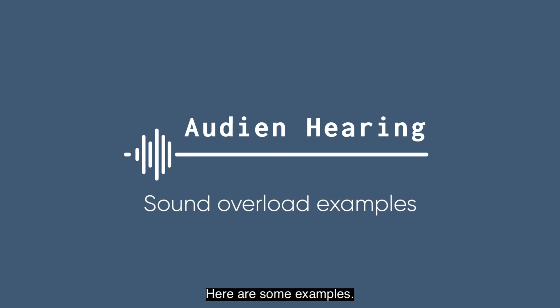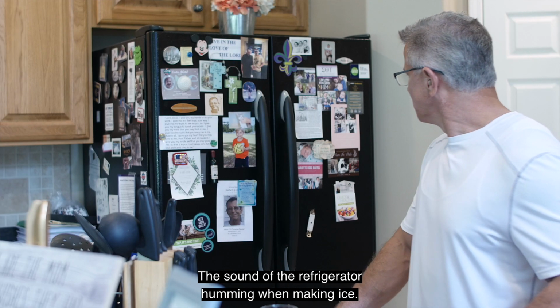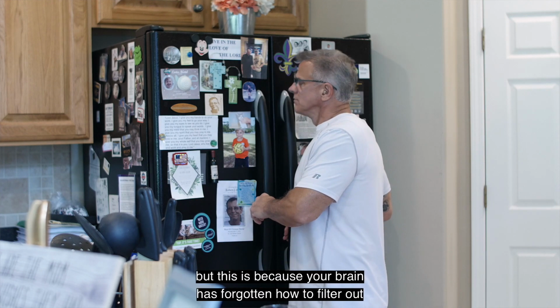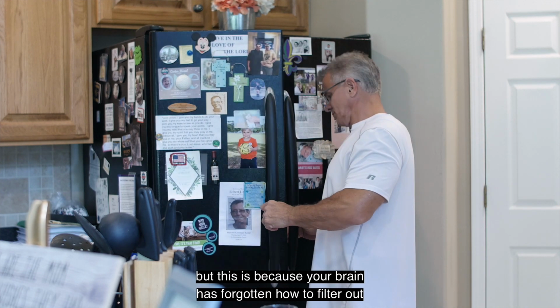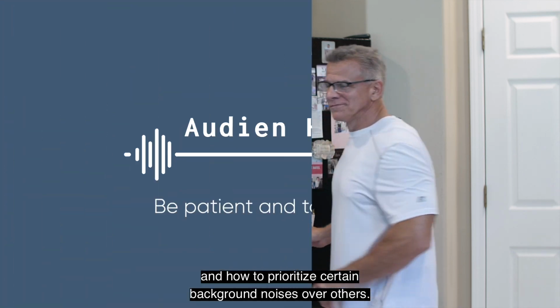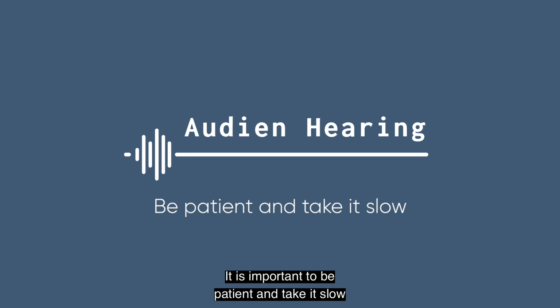Here are some examples. The sound of the refrigerator humming when making ice. This may seem loud and unbearable, but this is because your brain has forgotten how to filter out background noise and how to prioritize certain background noises over others. It's important to be patient and take it slow as your brain adjusts to your new hearing aids.